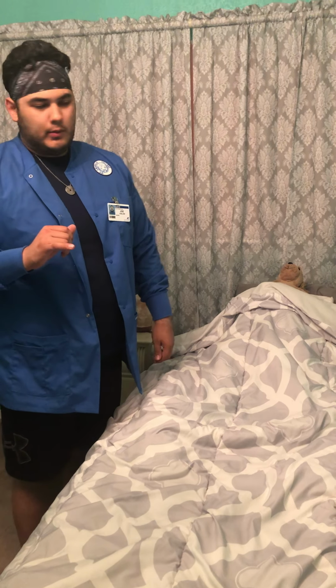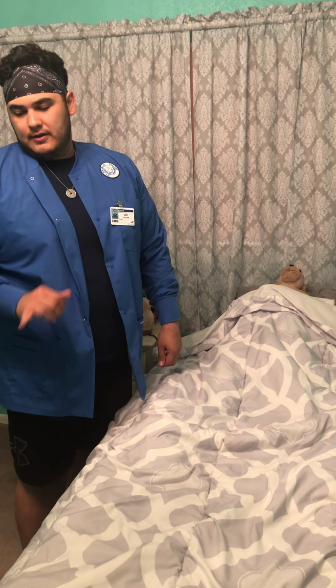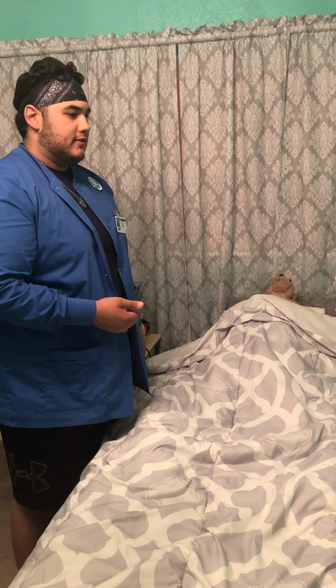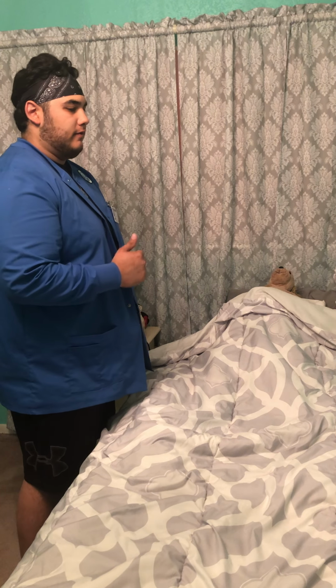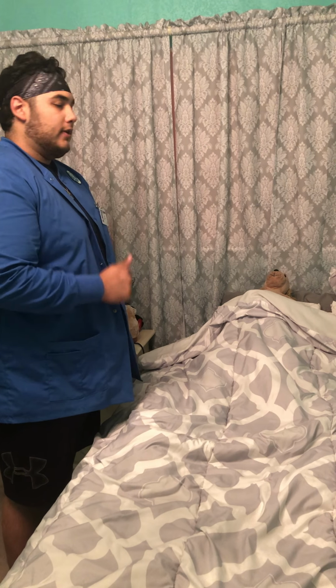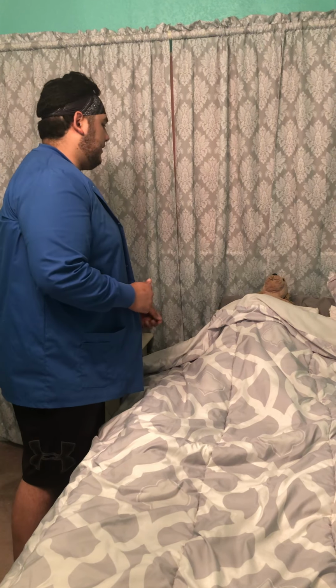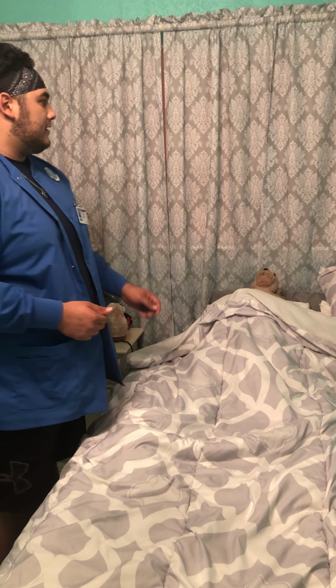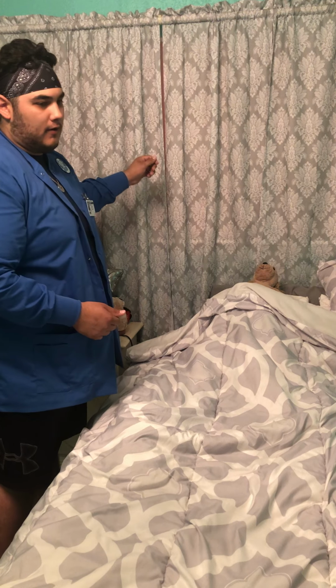Alright, so today we will be demonstrating inserting a urinary catheter. And so we're going to go ahead and start through that process. So we're going to verify the doctor's orders, which we have done. Then we're going to introduce ourselves. So, hello ma'am, my name is Gerald, I'll be a nurse this evening. And then we're going to provide patient privacy by either shutting the door or drawing the curtain.